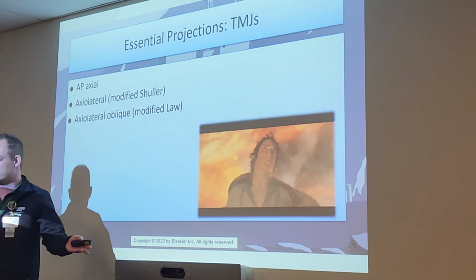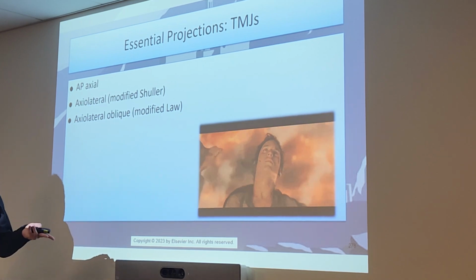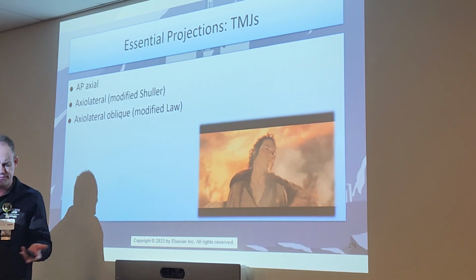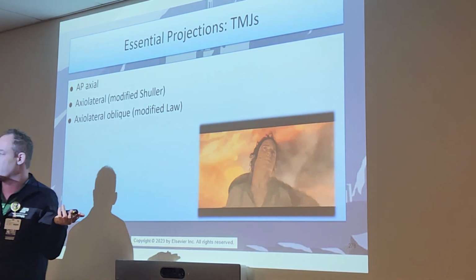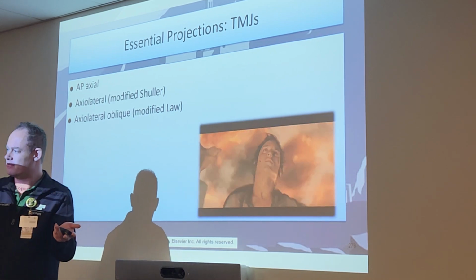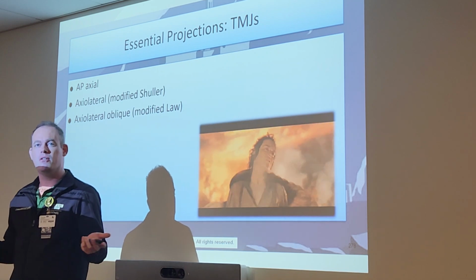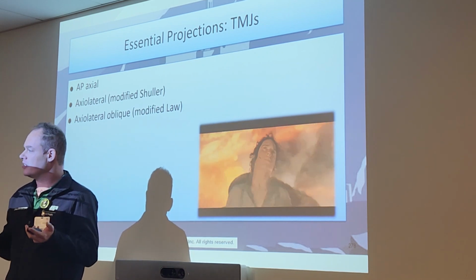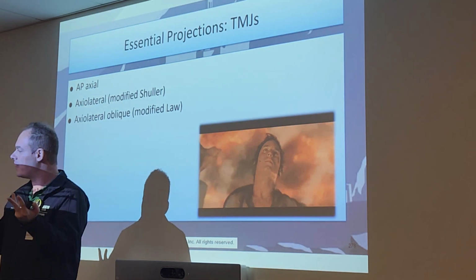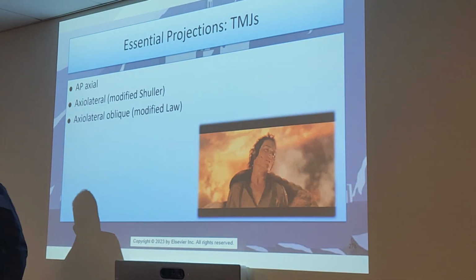All right, guys, speaking of TMJs, we've got 3 positions of the TMJs we're going to review now. It's been interesting to me that these have been coming a lot more often in the clinic areas. I've only done one of these my entire career. They're super rare, but apparently they're becoming more common through the clinics. You saw one at Strawberry, I know someone saw one someplace else. Of course, we're checking the integrity of those TMJs, making sure that those condyloid processes are fitting into that temporal bone correctly. They're not getting lockjaw or dislocation going on, which does happen quite often.